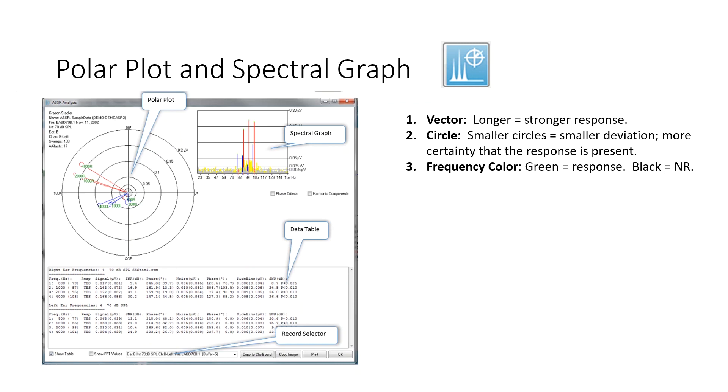The frequency color, the actual frequency, 4,000 hertz spelled out, if it's in green, that means it's a response. Black means there's no response. And the vectors, of course, I didn't mention, the red is right ear, blue is left ear.